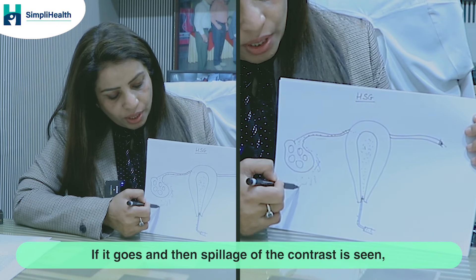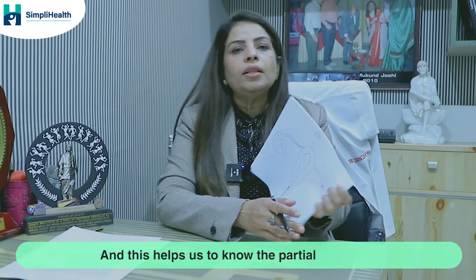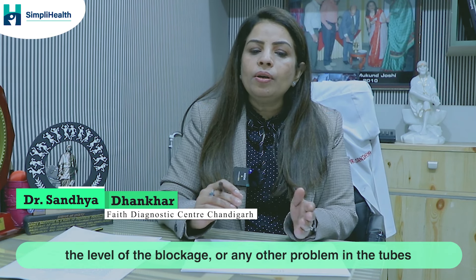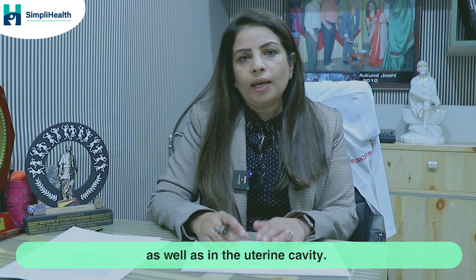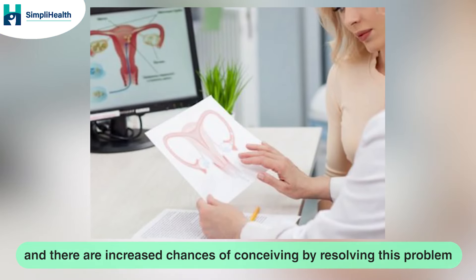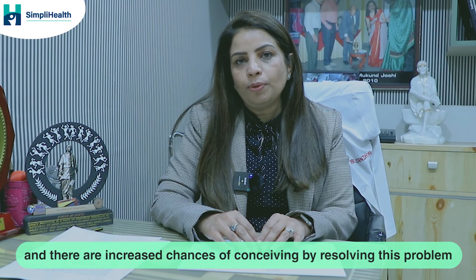If the contrast goes through and spillage is seen, that means the tubes are open and patent. This helps us know the level of blockage, partial blockage, or any other problem in the tubes as well as in the uterine cavity, which can be corrected by surgical means, increasing the chances of conceiving.